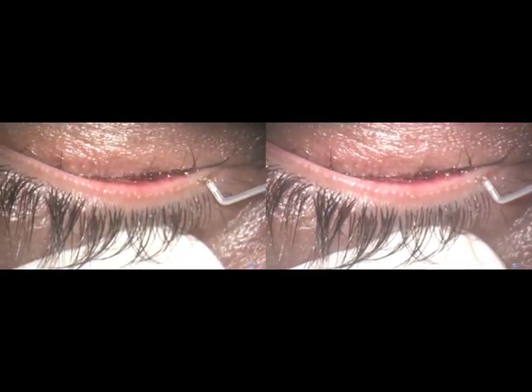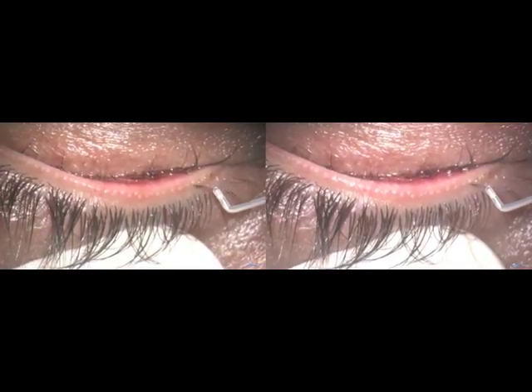I open the ducts only in one eye — the worse eye — and will do the other eye only if the patient says they have benefited. This patient had his other eye treated more than a month back and came back for treatment of the other eye, sure that he had benefited from the already operated eye.